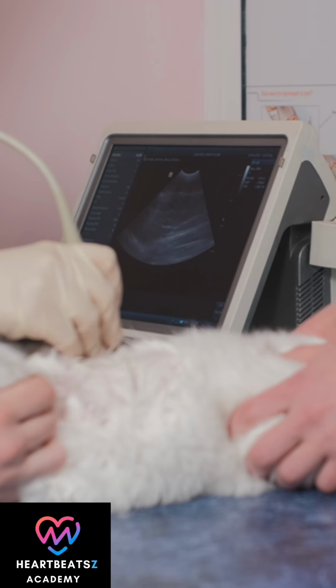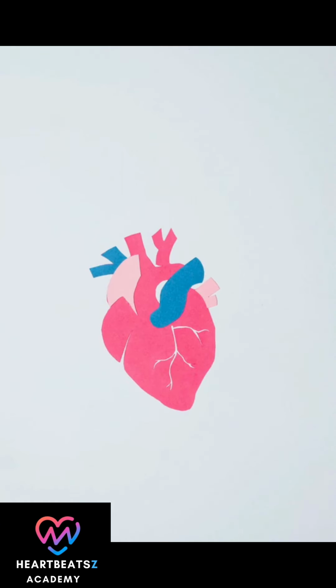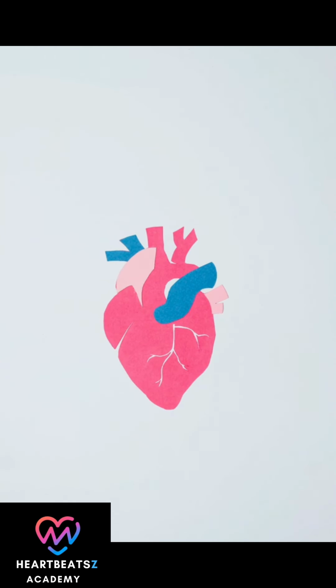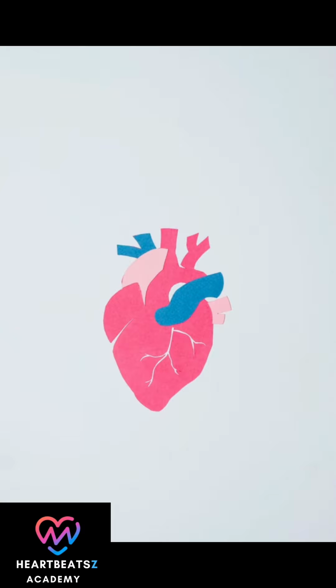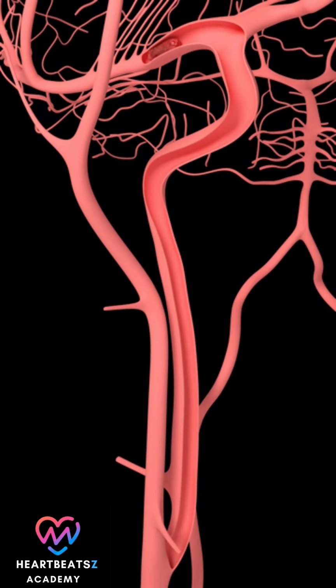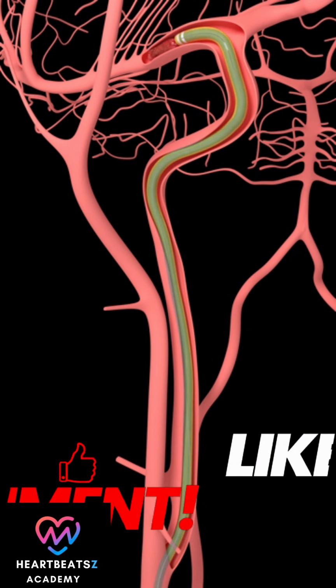Doppler ultrasound is a specialized technique that measures the direction and speed of blood flow. Deep vein thrombosis, DVT, the gold standard for diagnosing blood clots in the legs. Carotid artery disease, assessing for plaque buildup in the carotid arteries, in the neck, which can lead to stroke. Peripheral artery disease, evaluating blood flow in the arteries of the arms and legs. Aneurysms, detecting and monitoring arterial aneurysms.